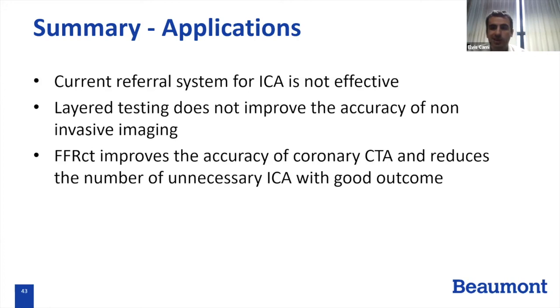Because we don't have a BMI cutoff, if your BMI is 45, we'll scan you. If your BMI is 50, we'll scan you. And those patients get, again, 120. If we need to repeat it and the BMI is high, then it gets a little tricky, because if you gave 120 the first time and then 120 the second time, that's a lot of contrast.